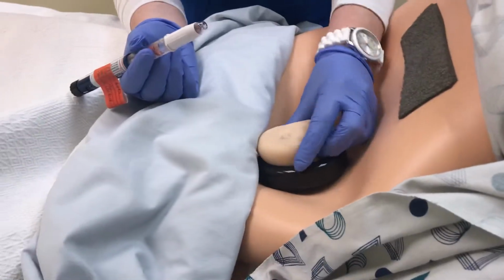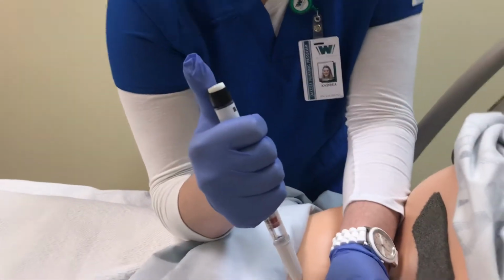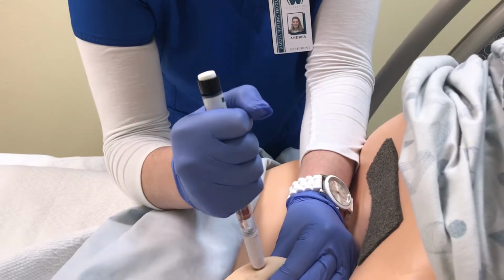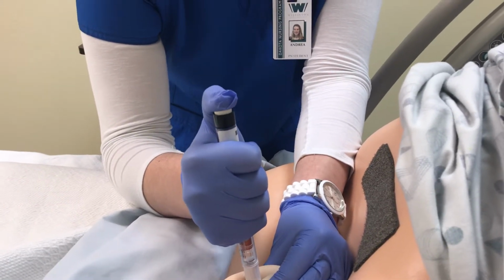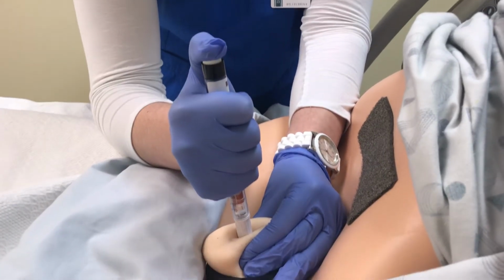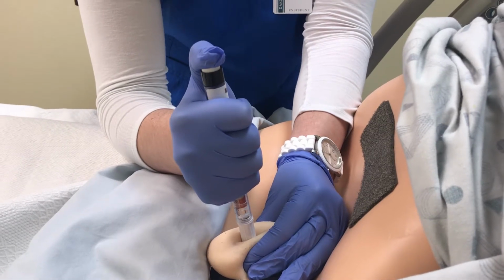So now that it's dry, I will pinch the skin. Okay, Shirley, on the count of 3, I'm going to inject it, okay? 1, 2, 3. Good. I'm going to go until I hear that click, and then I'm going to release and count for 10. 2, 3, 4, 5, 6, 7, 8, 9, 10.